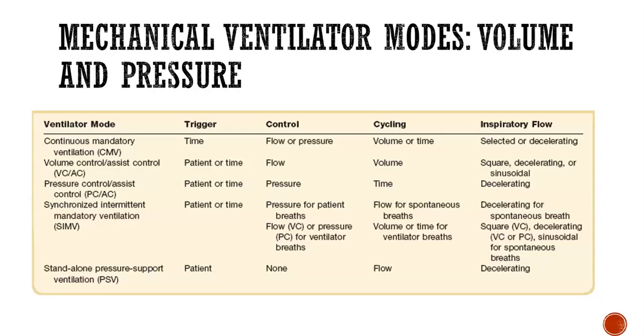And then we have PC, AC. So this is pressure control, assist control, and the other one is volume control, assist control.